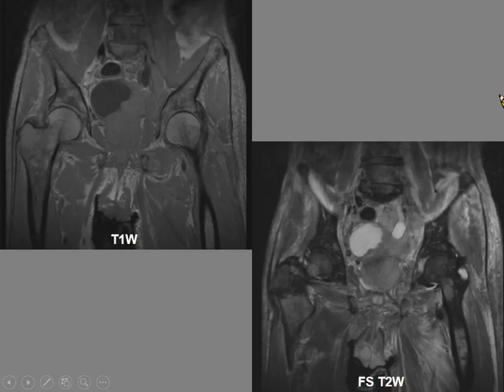Now, this is an elderly patient who fell and complained of hip pain and had an MR done to exclude a hip fracture because the plain radiograph was unremarkable. And the fellow who was reporting this was quite happy because he thought he had found the cause of the hip pain. You can see that the patient has got multiple metastases. But if he had looked harder, he would have seen the cause of it. In this case, what he did not see was the presence of a large lesion in the prostate. There was extracapsular involvement infiltrating the bladder base, as well as resulting in left hydroureter, like so. And this was in a patient with a prostatic carcinoma with bone metastasis. So this is just a reminder to look beyond the skeleton and to look for other pathology.